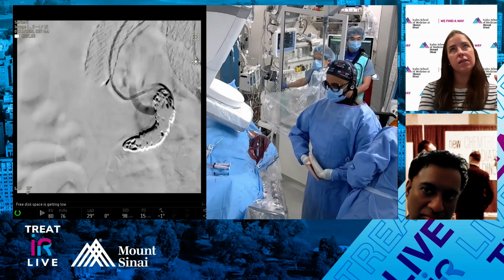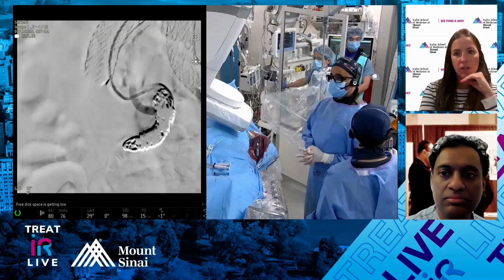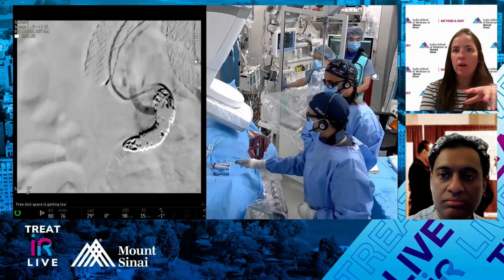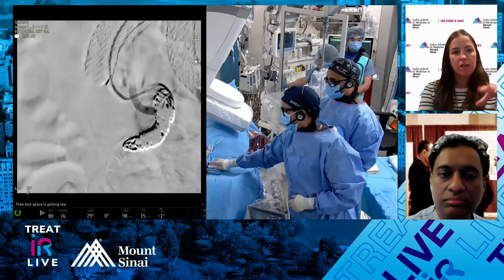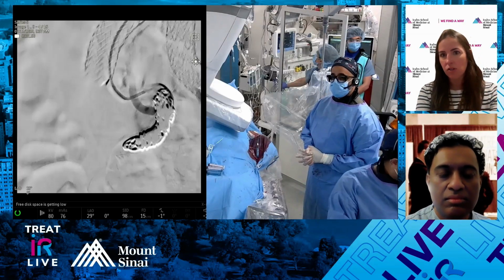And then I know we've been discussing this, and I just want to take a little step back for the people who are watching. We're talking about adding coils, where to coil to. Just tell us, you know, what's safe, what's our stopping point, how distal can we start?